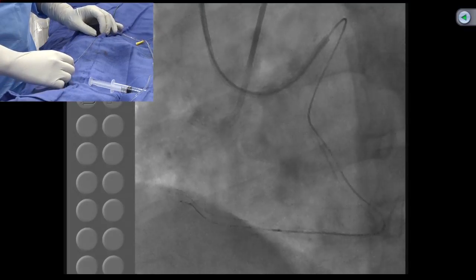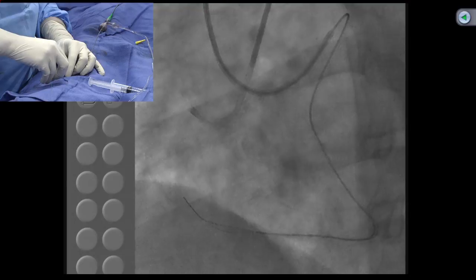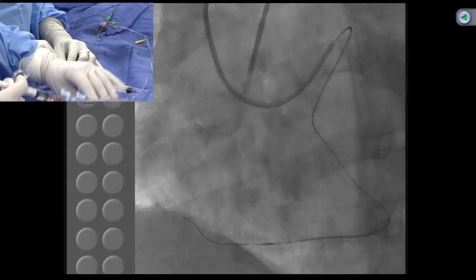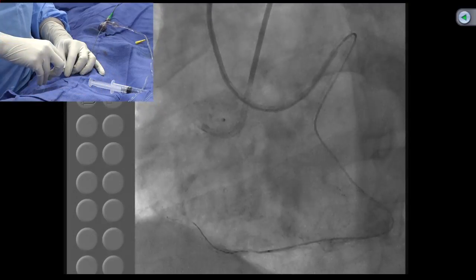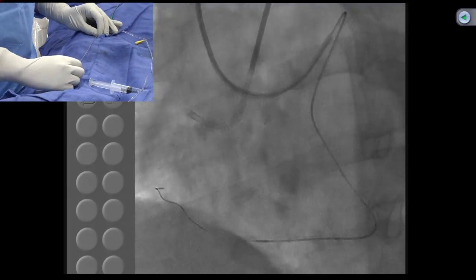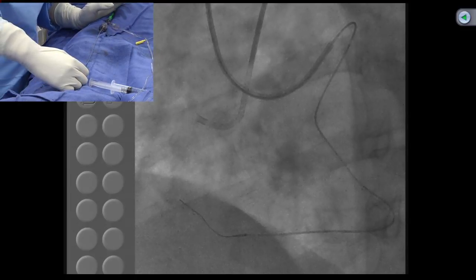You see the true use of IVUS in CTOs. Is there an over-reliance, because that kind of takes you down the re-entry pathway? Yeah, exactly. I think, as I showed in part of the slide, the more important use of IVUS is from the re-entry point of view. And I still believe IVUS has less role in the CTO, and even with the Japanese literature, we are actually seeing less impact and less outcome, or that IVUS does not impact that much in terms of your CTO recanalization.